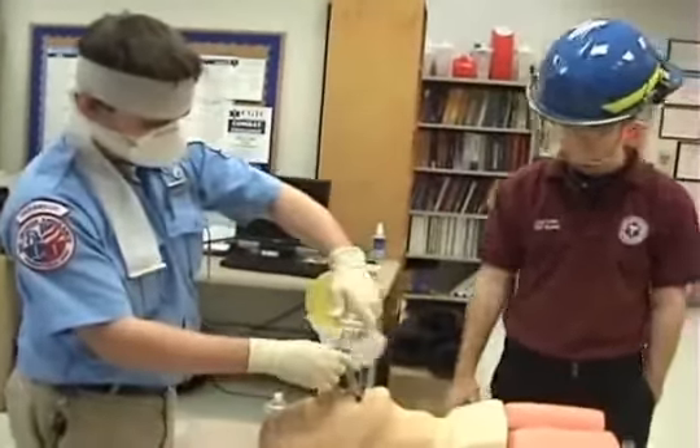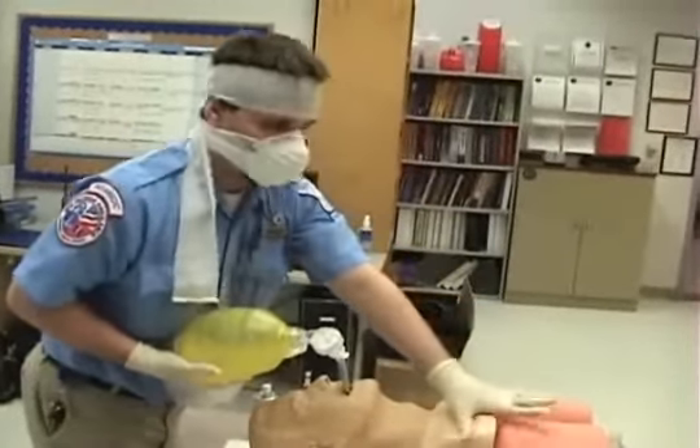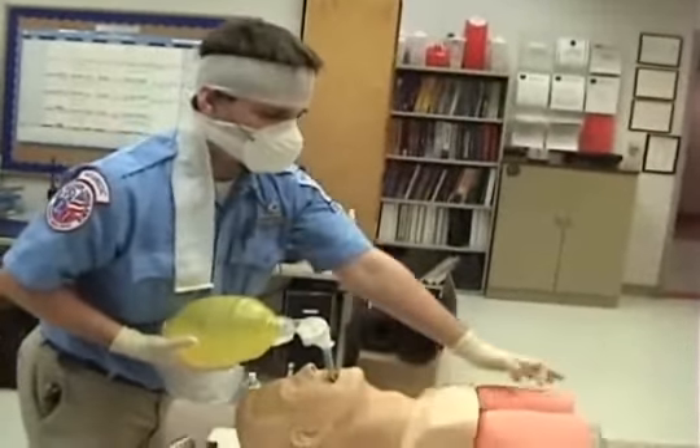We're going to ventilate through the number one tube. We're going to listen for epigastric sounds, watch for chest rise and fall, and listen for lung sounds.